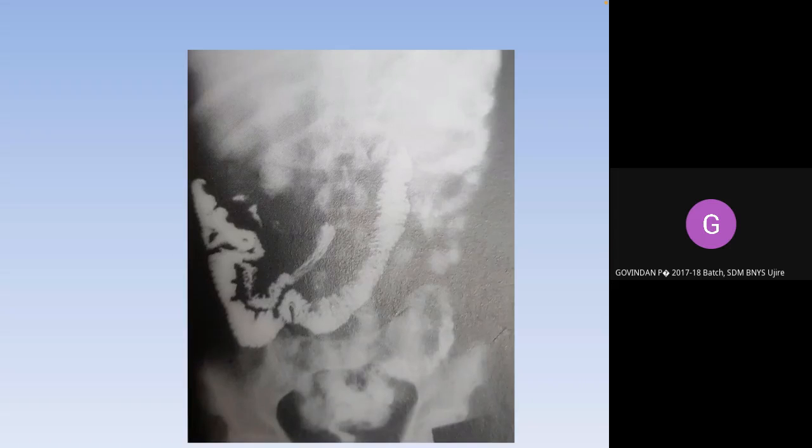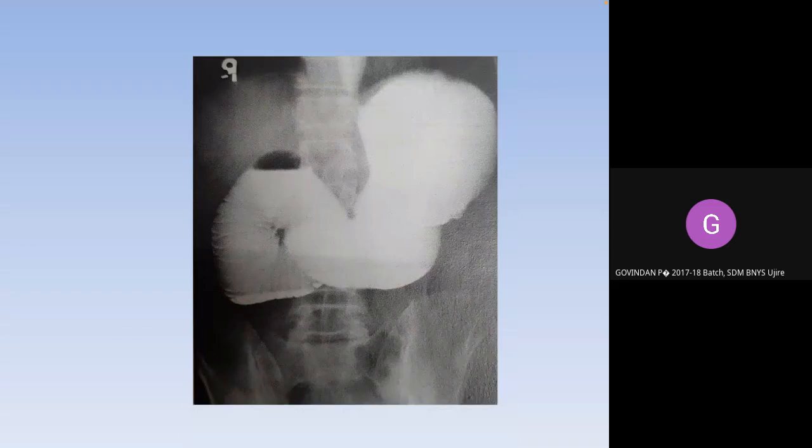Prolapse. No, not prolapse. There is a stricture here. I know it's a little difficult, but there's a stricture here. You can see this is thinned out. Normally, this is how it looks. This is also a stricture, but the image is not proper. It's rotated, so what you have given is in the stomach and the proximal part of the duodenum itself.